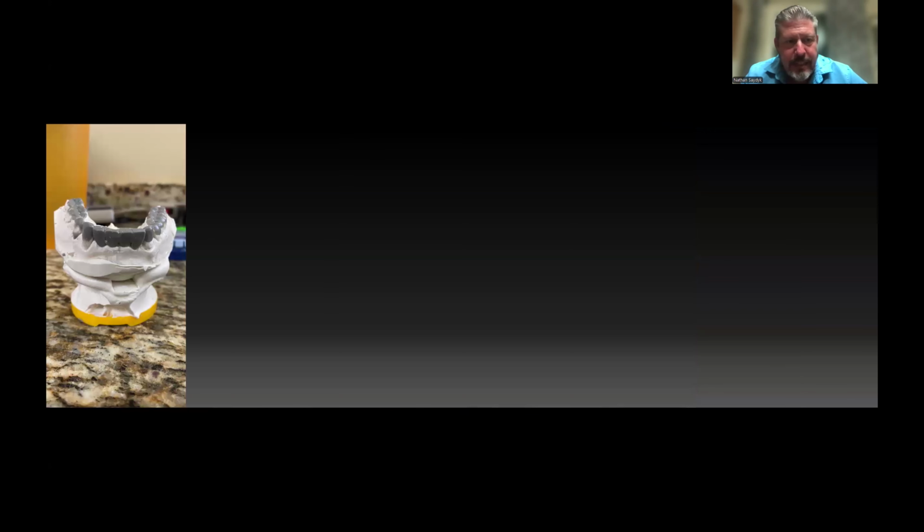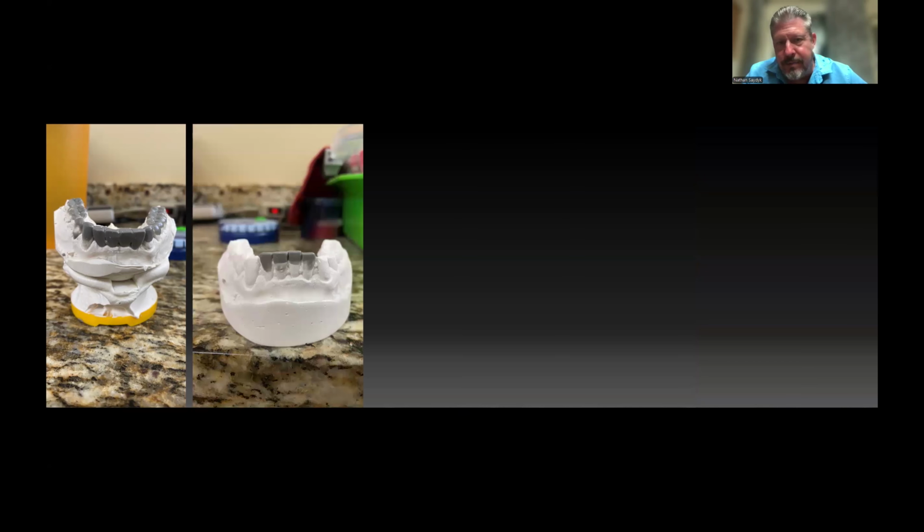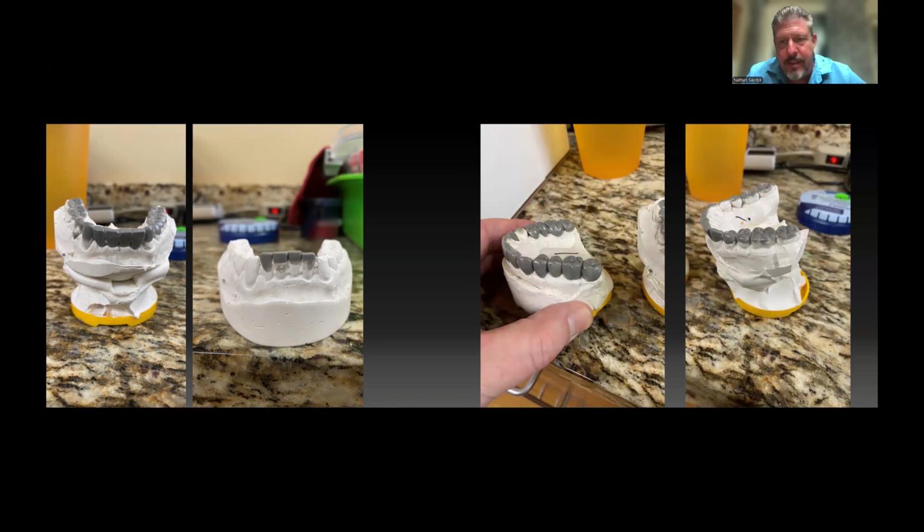So I sent them pictures. I said, here's what you sent me. That's what I wanted. I wanted it to look worse. I wanted the bite to be messed up. I wanted the height of those things to be proper. That's what you sent me. That's what I wanted. This is just occlusal stamps on these teeth. I'm just rebuilding the occlusal table, and I need to have a positive seat on the buccal and lingual. The patient was coming in a half an hour. I had to carve this stuff as fast as I could.